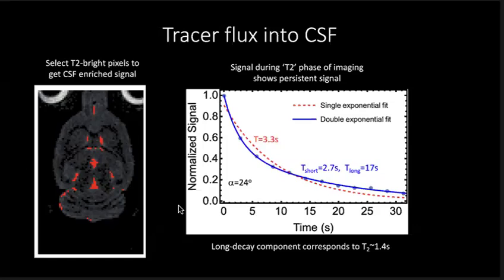If you try to translate that into a T2, which you can't do entirely, but you correct for tip angle and so forth, it corresponds to, I believe, a T2 of 1 or 2 seconds, something like that. So quite a bit longer than the T2s that we've been observing. Generally in the gray matter and so forth, it's sort of 300 to 500 millisecond T2s, and we're seeing this much longer T2 in the CSF. So any comments would be welcome.